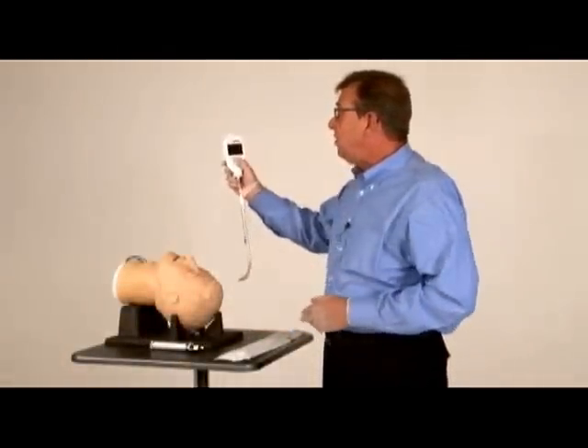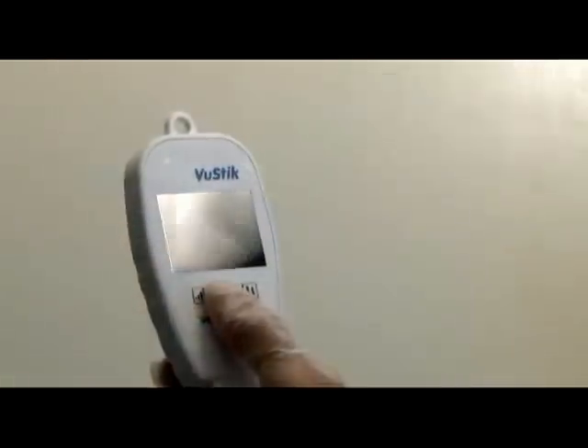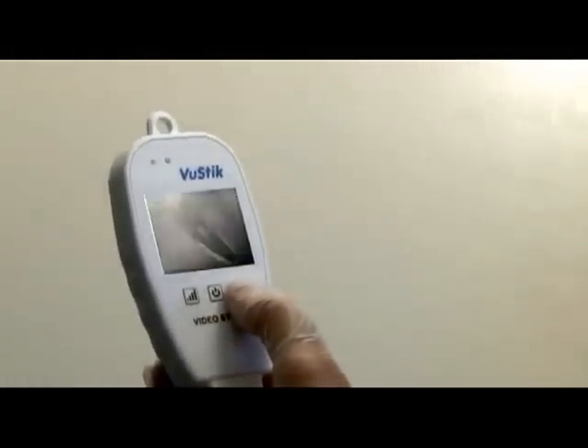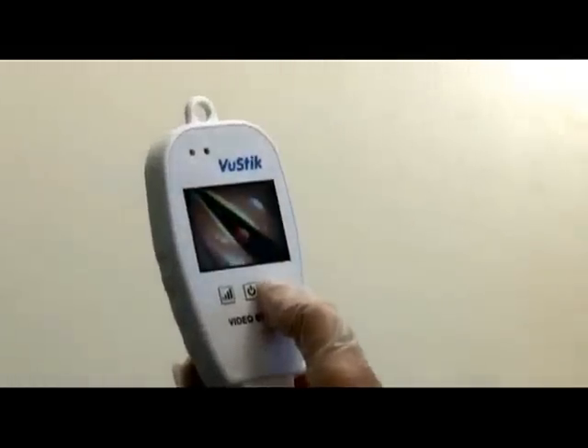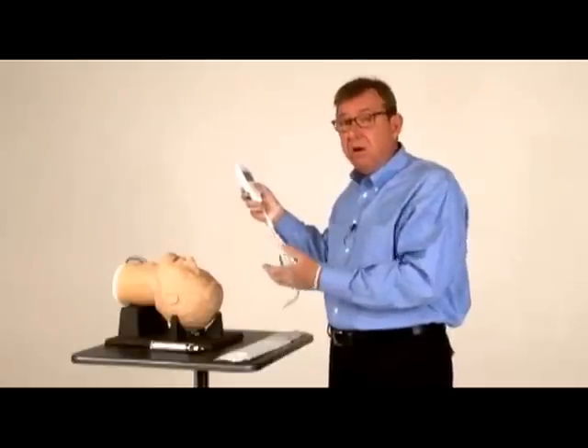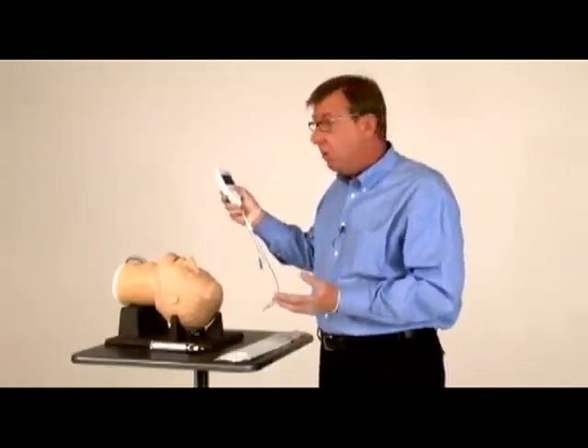You turn on the screen with this button. You increase or decrease the brightness with this button. And with this third button, you can actually flip the image, which makes it possible to intubate a patient in tight, restricted quarters where you have to approach them from their head, or when they're trapped in a car or immobilized on a KED board.